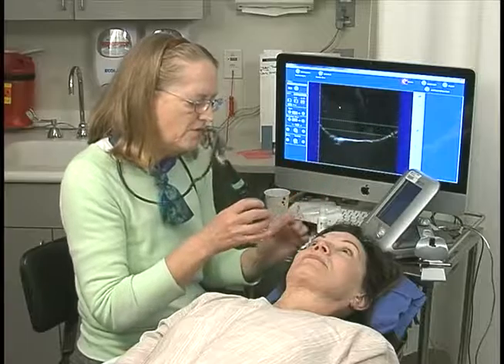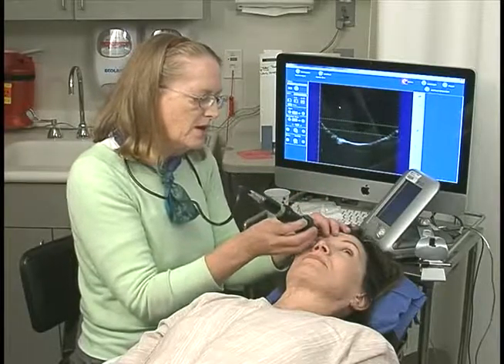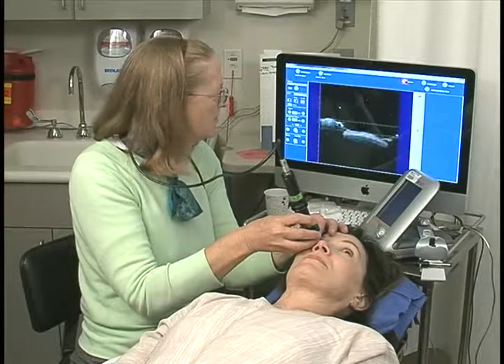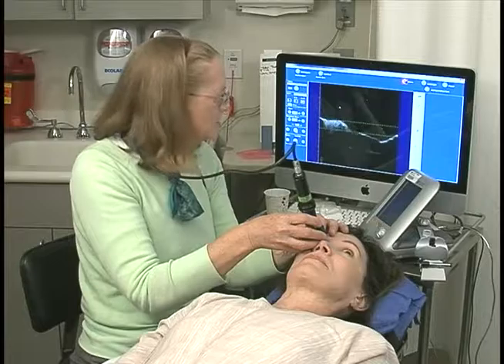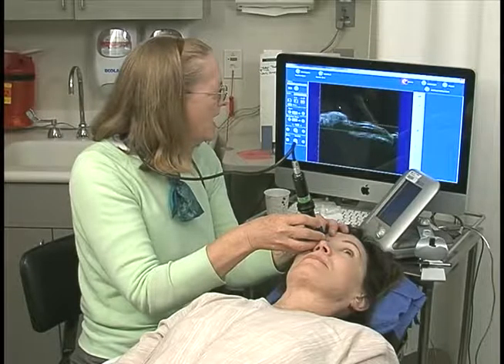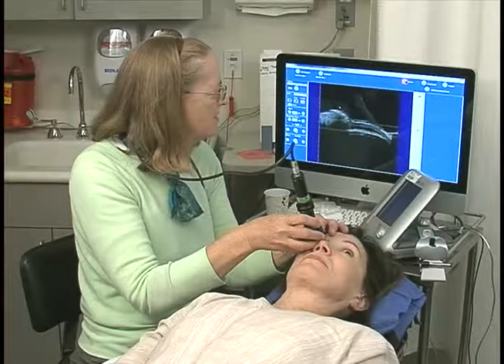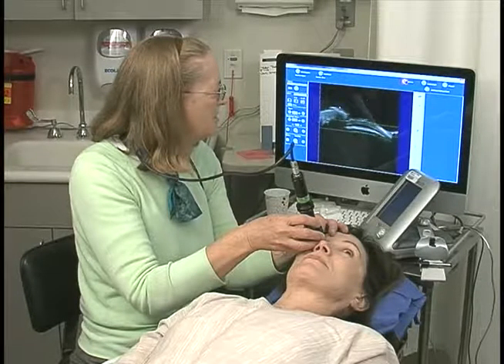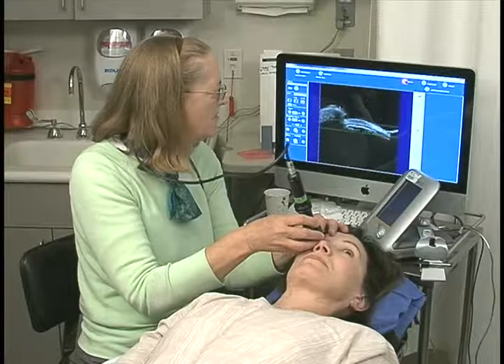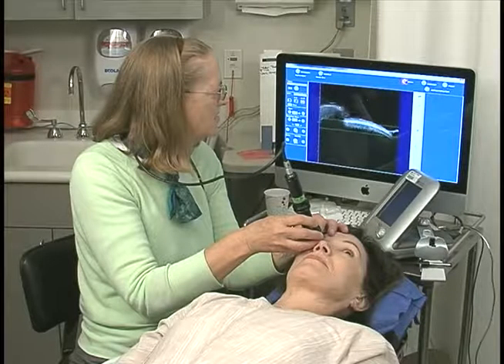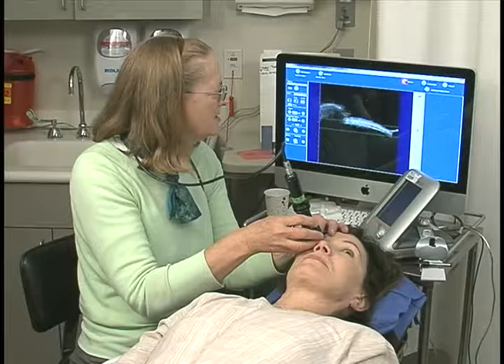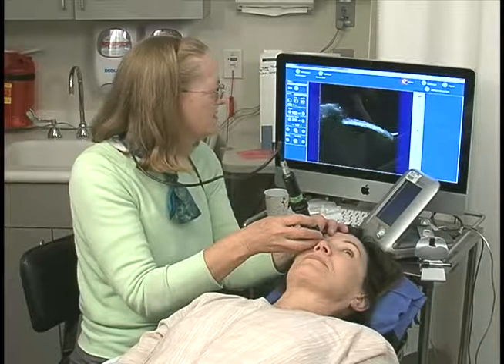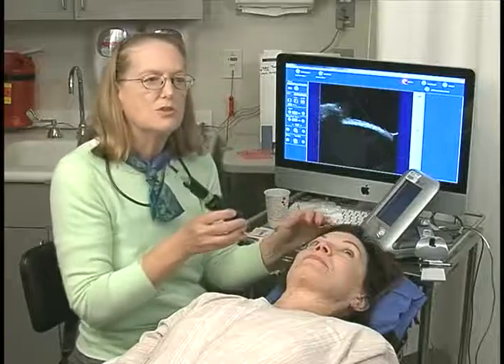Look a little to the left for me — where I lost some contact. So I can go way out to the periphery. There's her anterior lens capsule, the iris. I keep going farther out, farther out, ciliary processes, and then past to the ora serrata.